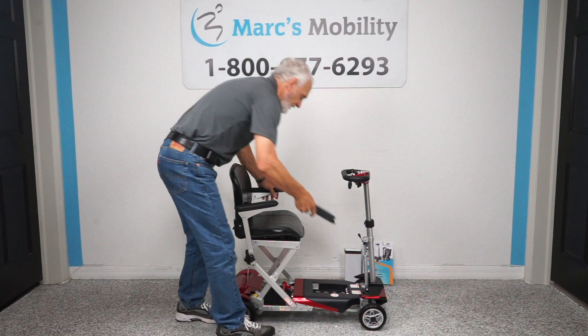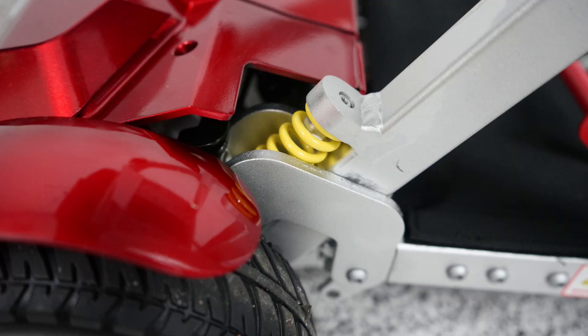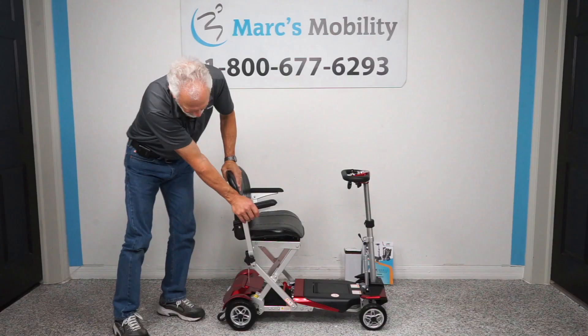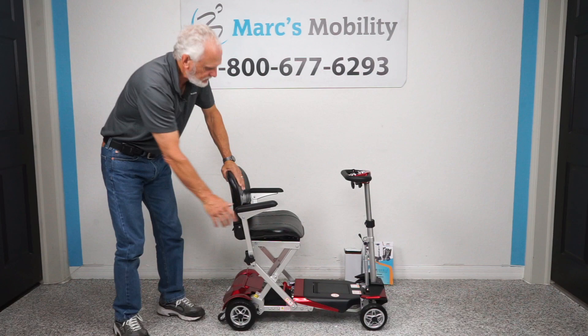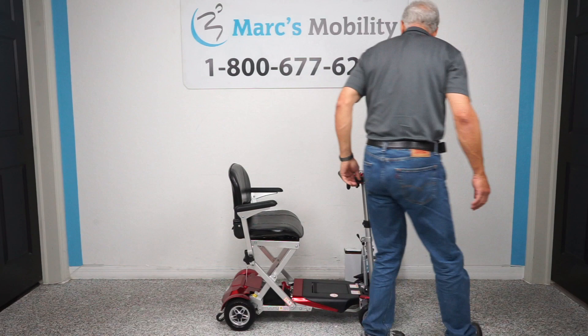The wheels on this scooter are solid tires. The front are six inch by about one inch; the back are seven inch by two and a half inch wide. You have suspension right here — you can see if I push down, you can see the suspension going. You also have an adjustable tiller right here, which most scooters don't have, and you can also adjust the height of the tiller.